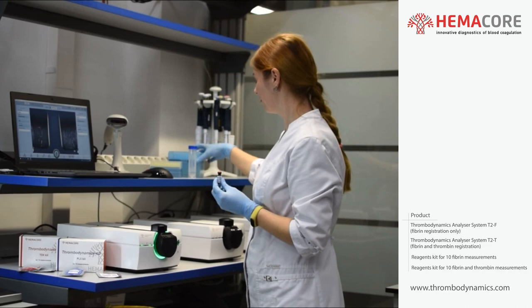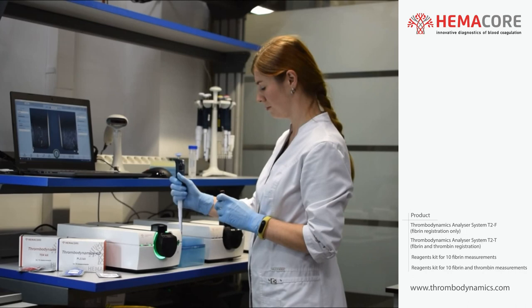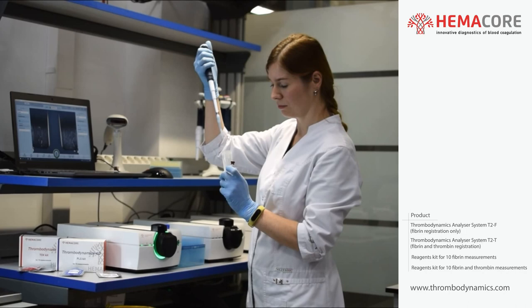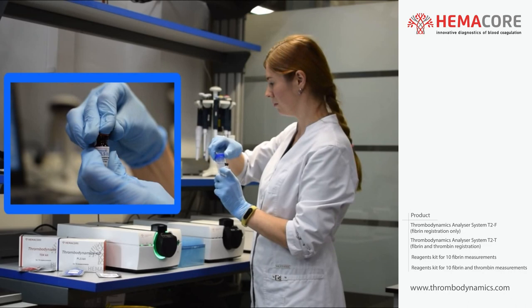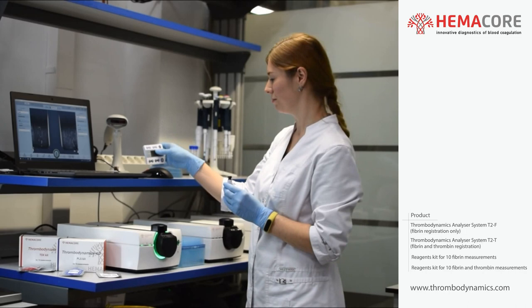Preparation of reagent PLS. Reagent PLS is a lyophilized suspension of phospholipid vesicles. To reconstitute the reagent PLS, distilled water should be utilized. Reconstituted reagent PLS can be stored at +4°C for 14 days. Using a pipette with disposable tips, add 300 µL of distilled water into the vial with reagent PLS. Do not allow freezing of the liquid reagent PLS during storage. Shake gently and dissolve the content of the vial for 5 minutes.